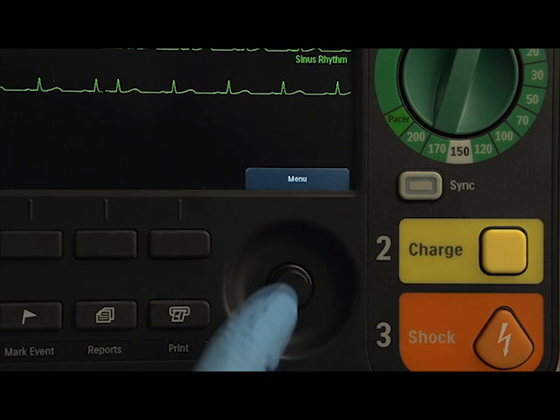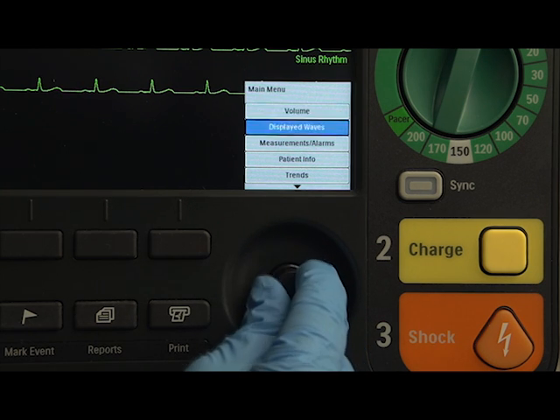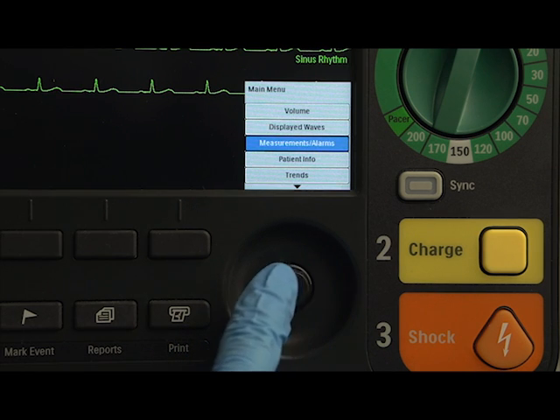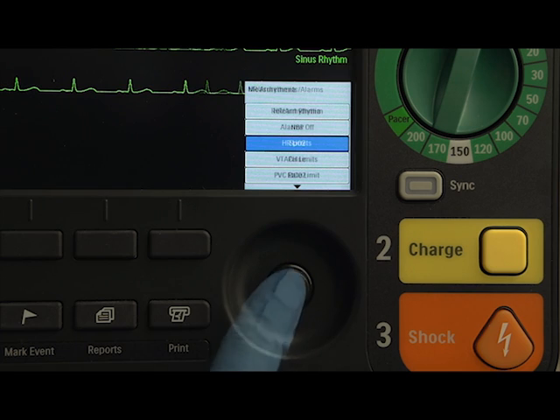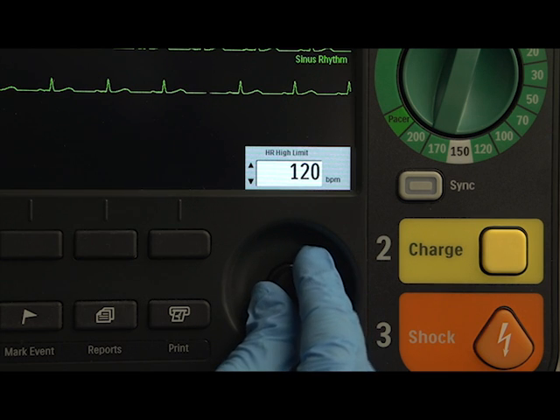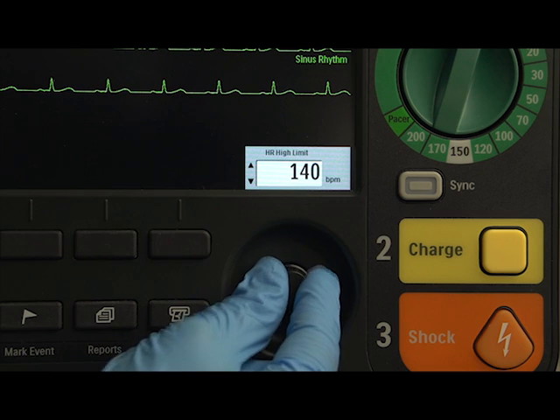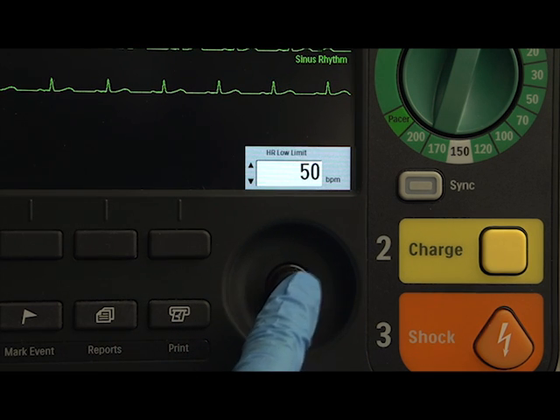This is the Smart Select knob. Press it and the main menu displays. Turn the knob clockwise or counterclockwise to scroll down or up a menu's list. Press it again to select that item. If you have a numeric selection window open, turning the knob clockwise increases the numerical value, while counterclockwise decreases the value. Press it again to select that value.